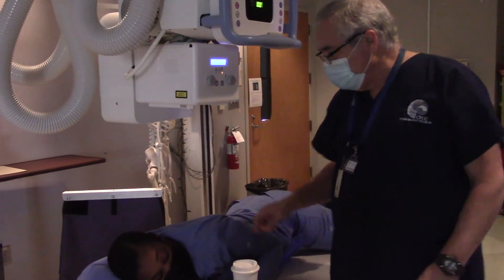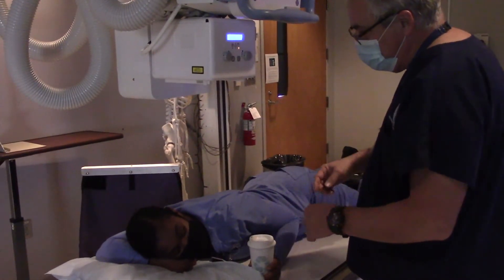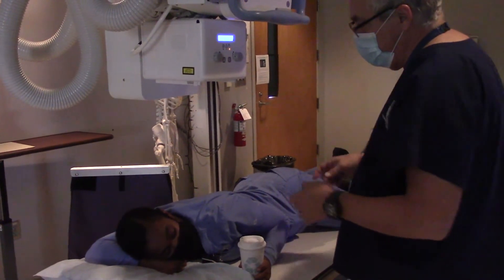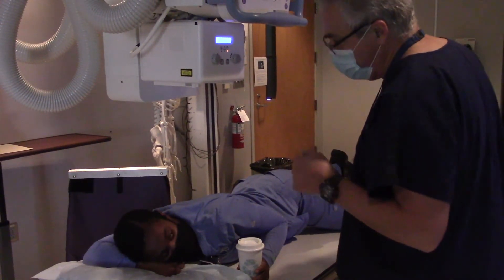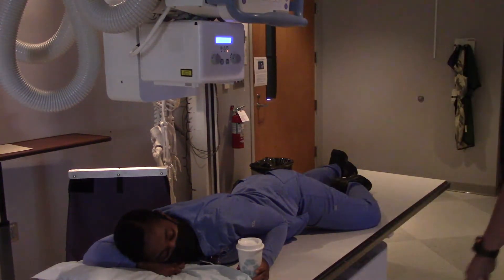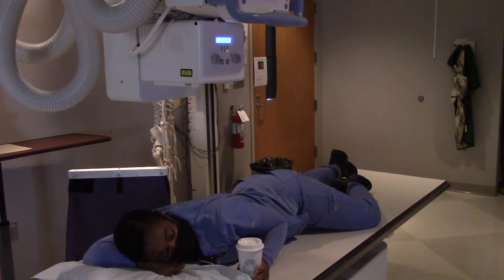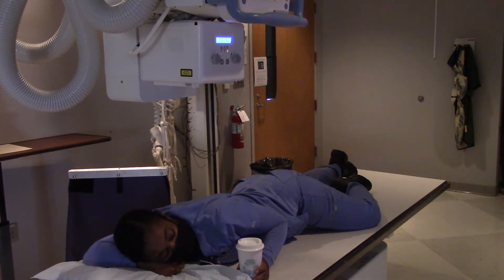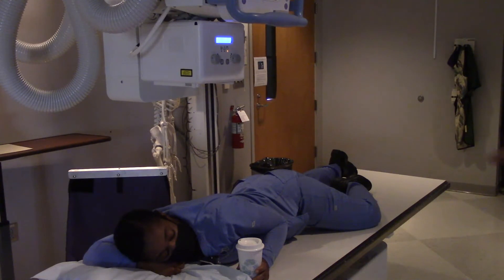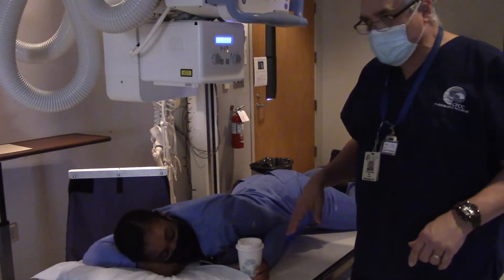So, are you ready? Okay ma'am, what I'm going to need you to do is just take some nice steady sips from this cup, and while you're doing that we're going to take an x-ray. All right, very good — now go ahead, start drinking. All right, we're drinking — beep! Okay. All right ma'am, you can relax, you don't have to drink any more of that barium.